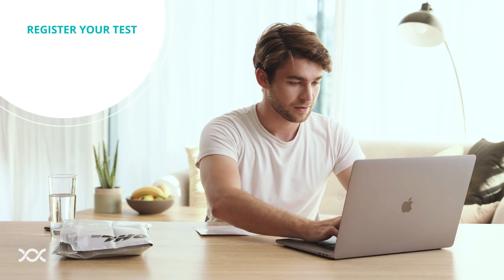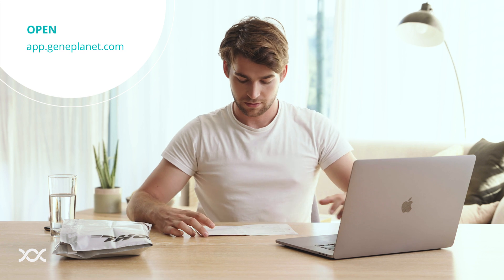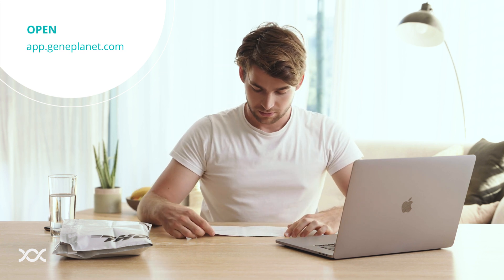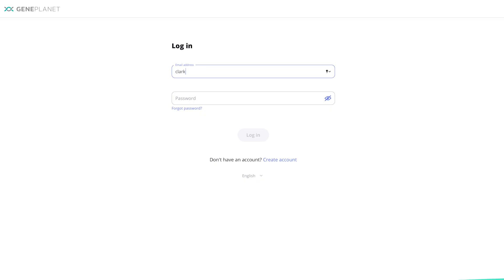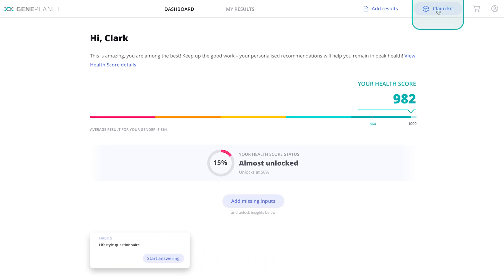First, and one of the most important steps, is to register your test. In your web browser, open app.geneplanet.com, where you can log in or create an account. Once you are logged in, click the Claim Kit button.